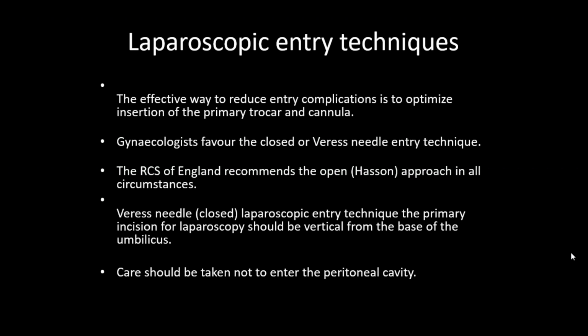How can we manage those high-risk patients? We have two possibilities. The Royal College of Surgeons in England or UK recommends the open Hasan technique or approach.